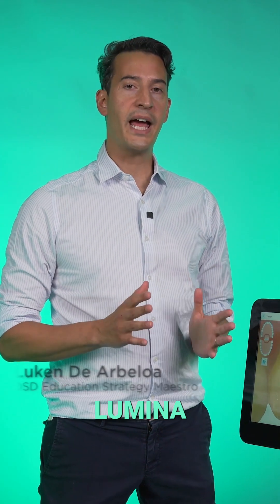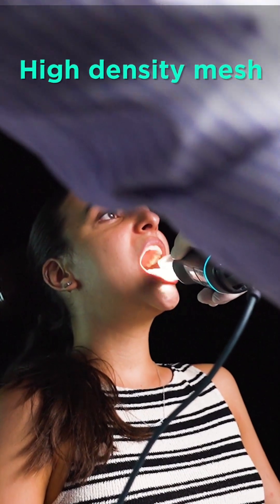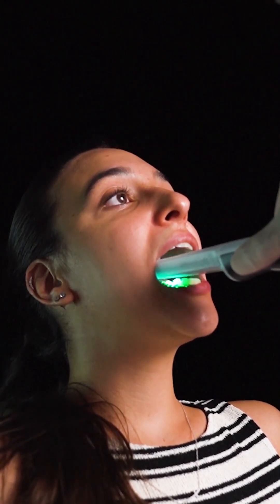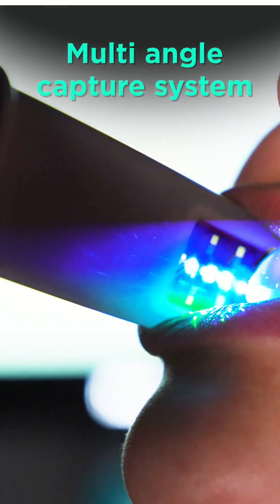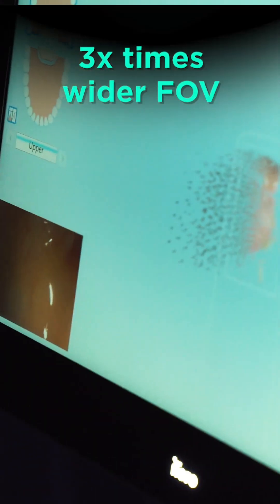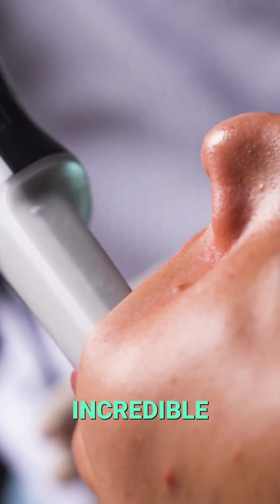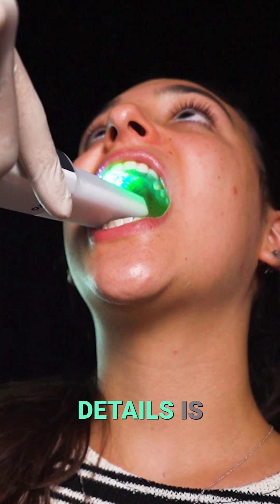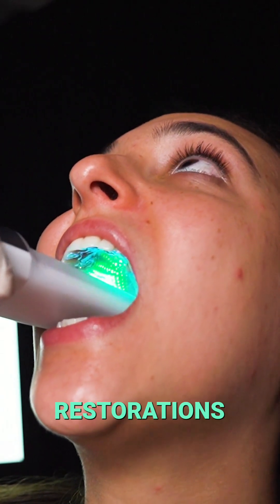We chose the Aetero Lumina because it gives us what matters most in restorative dentistry: accuracy. Its high-density mesh captured tooth anatomy in stunning detail, on par with the top scanners in the world. Thanks to its six cameras, multi-angle capture system, three times wider field of view, and 25 mm depth range, we get incredibly precise data even in the most challenging areas — and that level of detail is exactly what we need to fill our new natural restorations library.